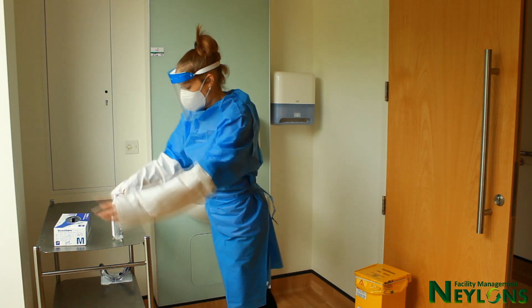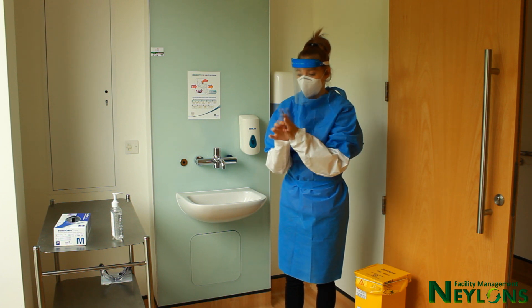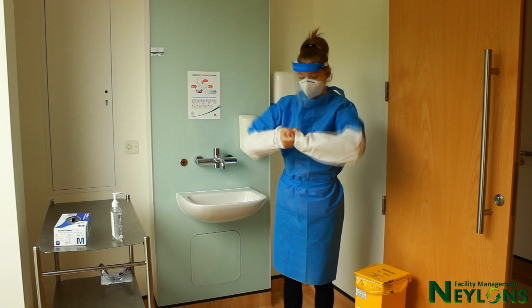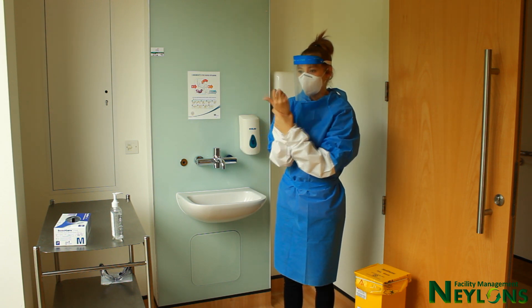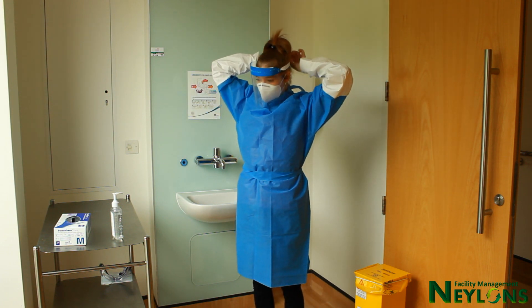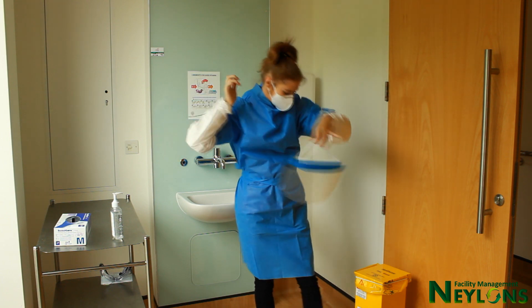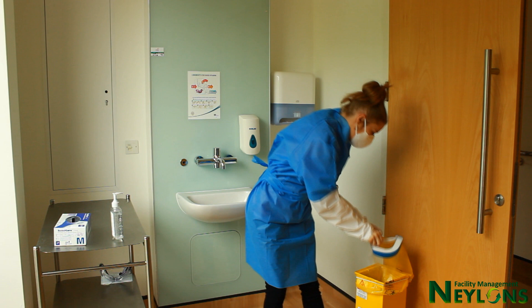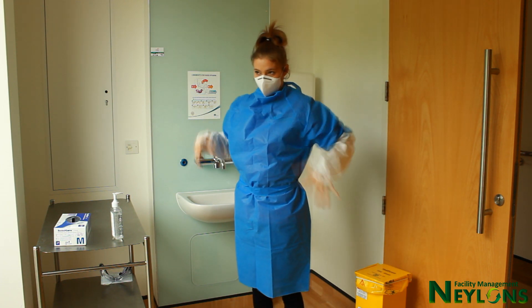Decontaminate hands. Do not touch the facial shield at the front as this is contaminated — remove from the back. If goggles are not single use, put on clean gloves and decontaminate before placing on any other surface.